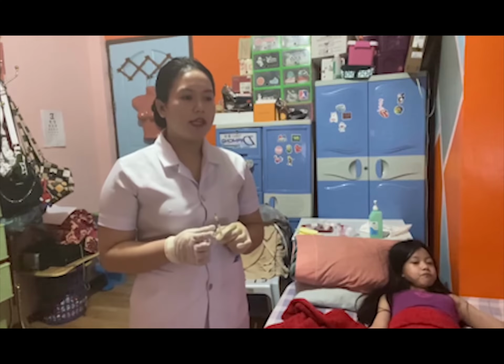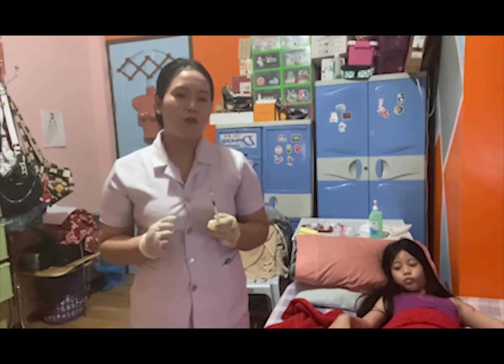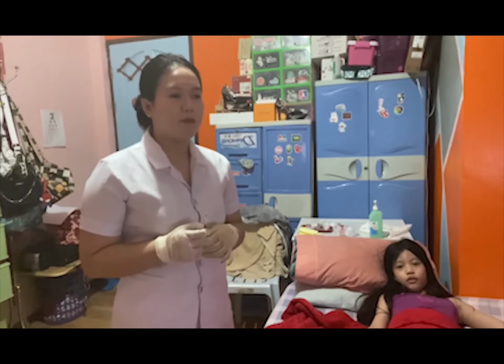Then bring the needle very close to the patient's skin and insert it slowly at a 5 to 15 degree angle until you feel resistance. Then advance the needle into the epidermis about 1/8 inch or 3 millimeters. Then slowly inject the medication to the patient.